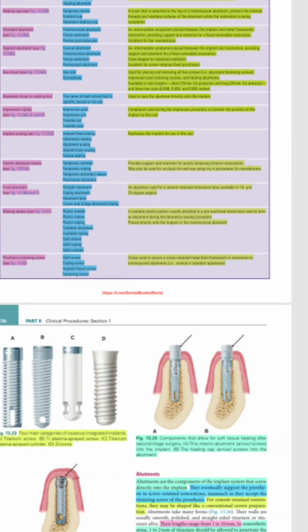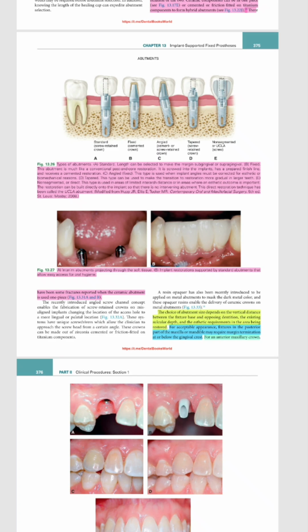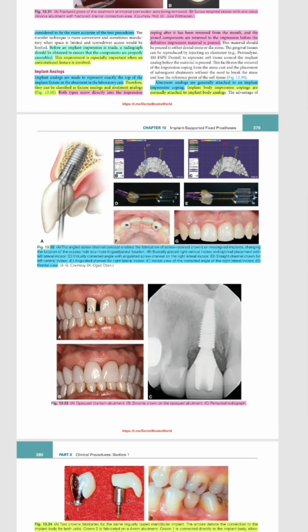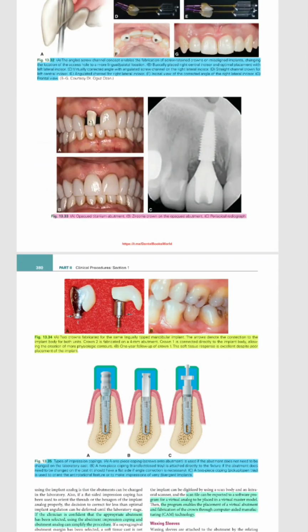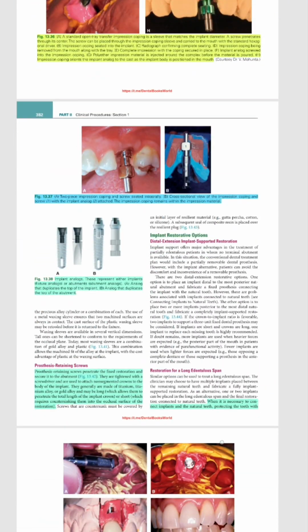So we had brief concepts regarding the types of the implants, the procedure of implantation, the types and terminology of all the components, some considerations during the prosthesis procedure, and some cases that made the concepts clear with all the advances in the technological aspect that we are living in now.